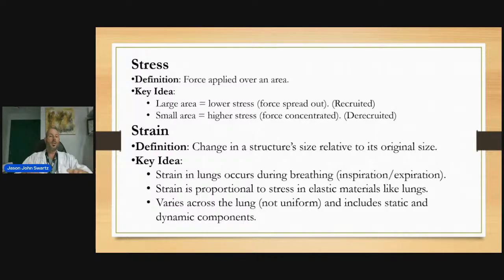But likely in a lung in this situation, even the alveoli that are potentially open, there's a large variation in time constants. So the lung is not yet uniform, and you will have, first of all, an increased strain in the areas that are opening, and within the areas that are opening, because of the different time constants, you can have areas that are, let's say, healthier becoming over-distended.